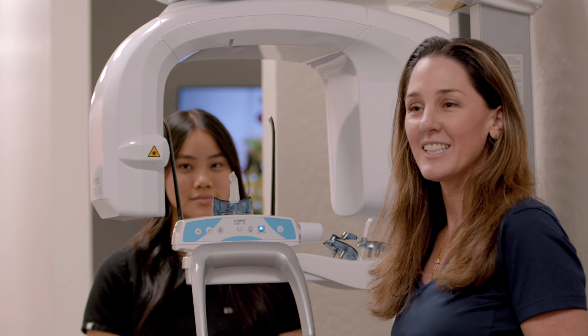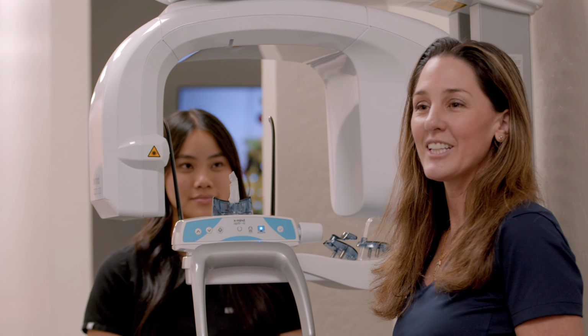Okay, so we have Vicki here at the unit, but I'm going to quickly explain a couple things with our bite sticks and our chin rests. So right now we have our standard bite stick in, and again, that's probably 90% of the time what you're going to use.